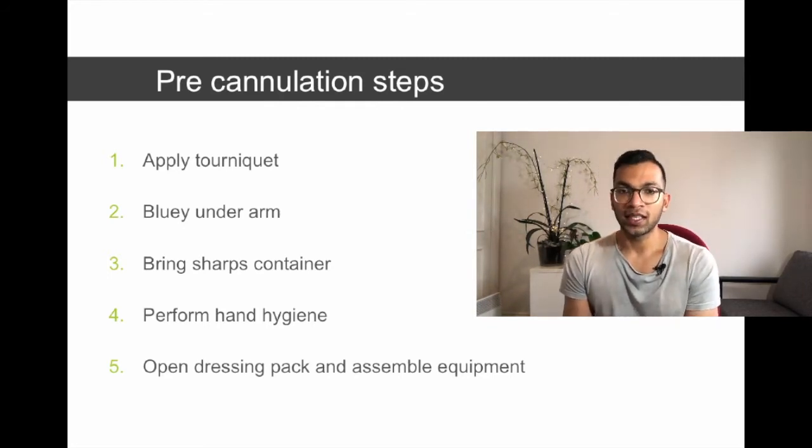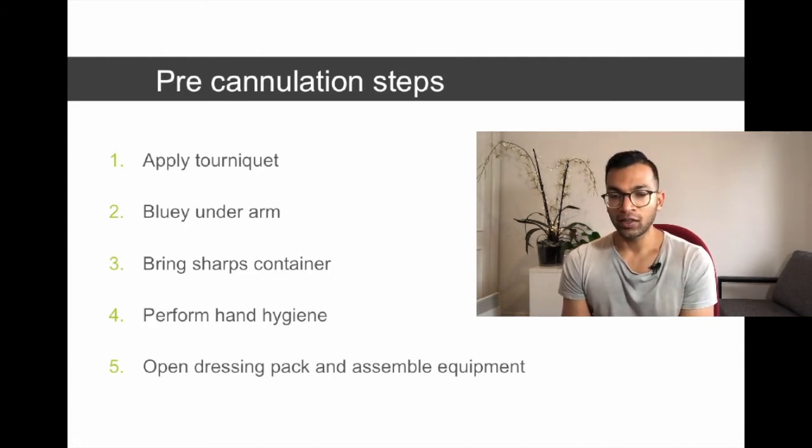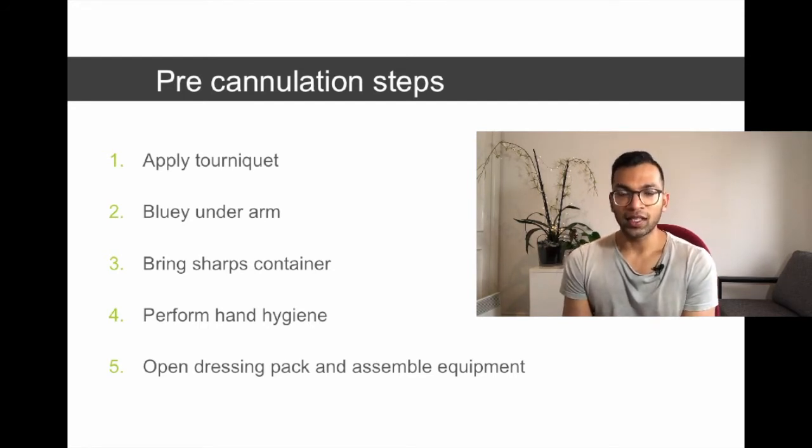Always bring a sharps container nearby. At all costs, you want to ensure that you avoid any sharps injuries. The sad truth is that a lot of us will suffer sharps injuries through our career, and it's just something you really want to avoid by having these good practices in place straight away. Perform hand hygiene, and always think of the 5 moments of hand hygiene as shown by the WHO.